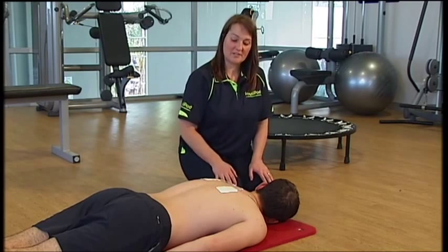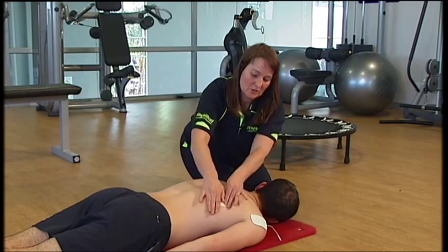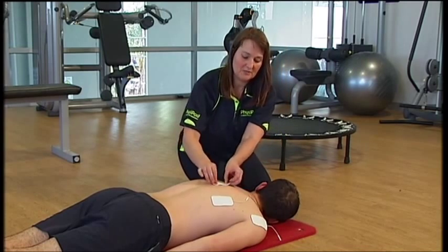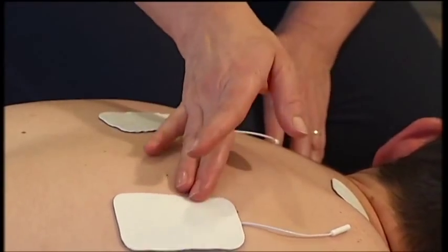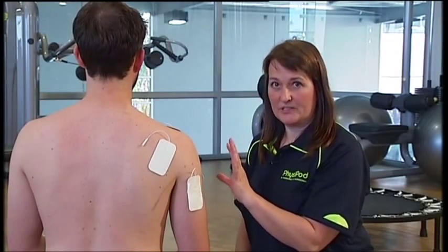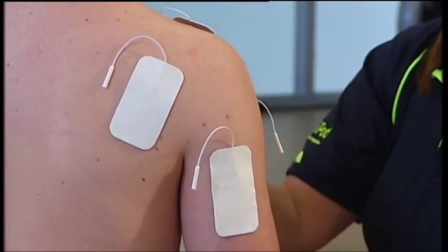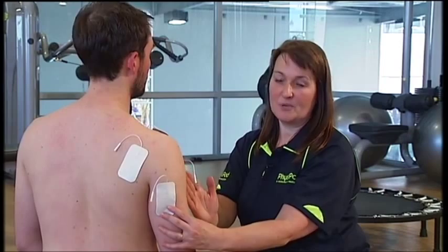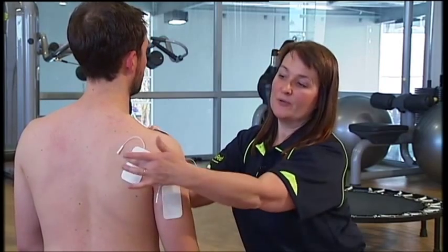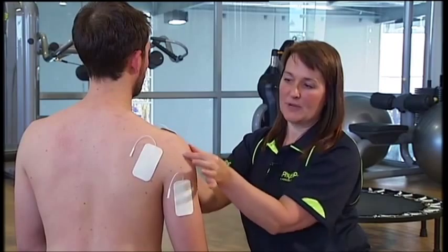If your pain was more one-sided, we would adjust these electrodes to accommodate — one on that outer shoulder, one on the lower ribs, one in the middle, and one placed closer over the neck, circling that whole area for anyone with neck and right-sided shoulder pain. If you had just a straight shoulder pain not really associated with the neck, an ideal placement would be one over the posterior rotator cuff muscles over the back of your shoulder blade, one just on the upper part of your triceps, one on the front part of your deltoid, and the other one mirroring that on the front part of your shoulder — covering the whole square with the main pain in the centre.